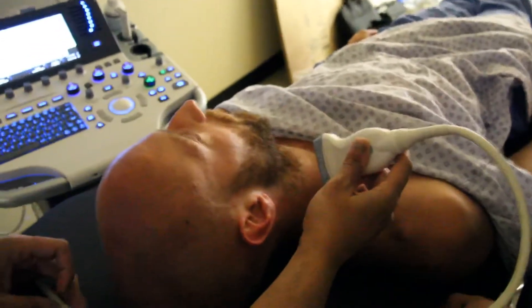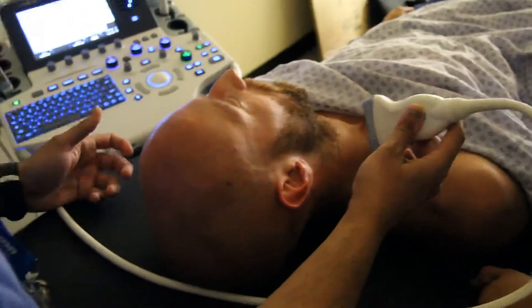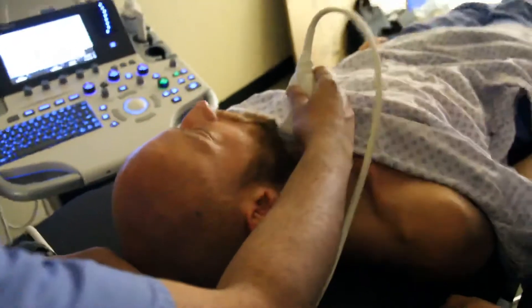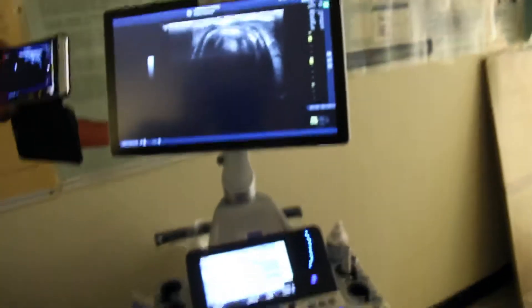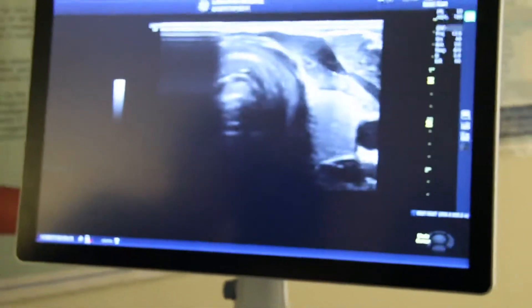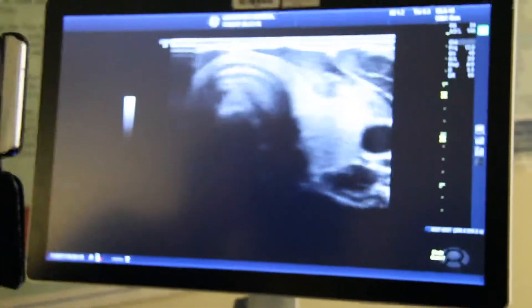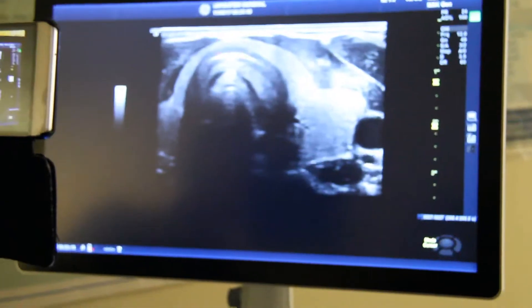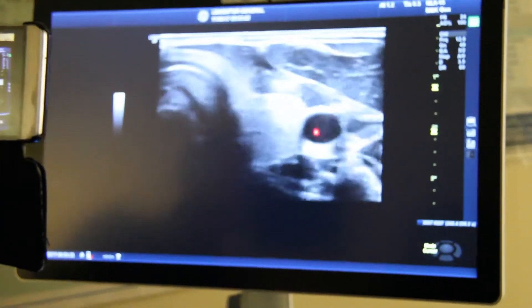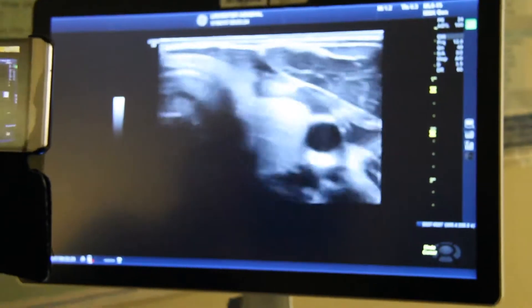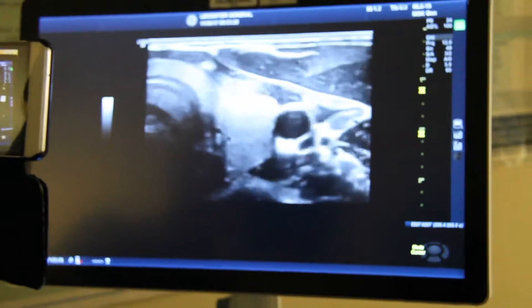We're going to do the cervical middle cervical sympathetic chain block — what we call the stellate ganglion block. To do the block, always start by scanning from the midline. Look for the trachea, then the thyroid gland — I'll show you the structures on the screen with my pointer. That's your tracheal rings, here you have your thyroid gland. When you start to move laterally, you have your carotid artery.